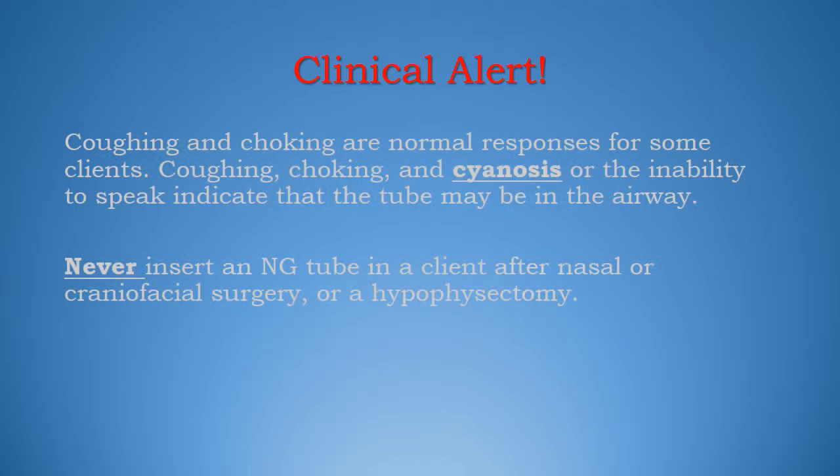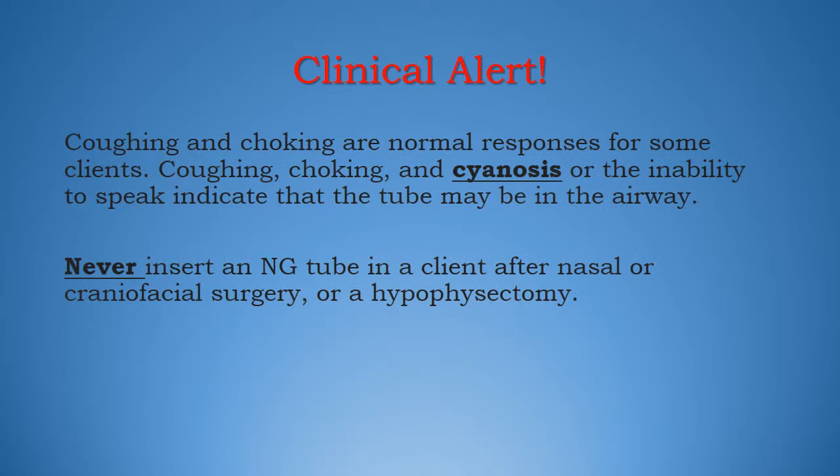Clinical alert. Coughing and choking are normal responses for some clients. Coughing, choking, and cyanosis, or the inability to speak, indicate that the tube may be in the airway. Never insert an NG tube in a client after nasal or craniofacial surgery or a hypophysectomy.